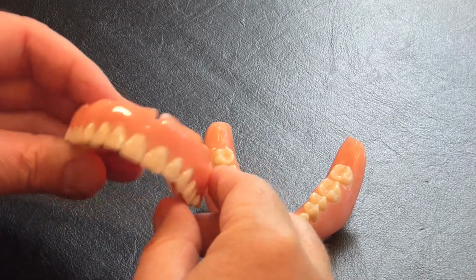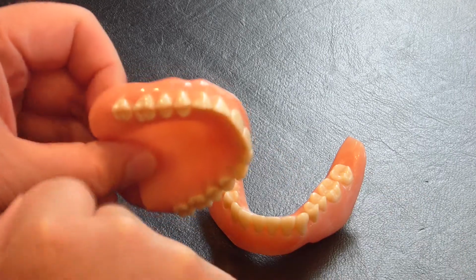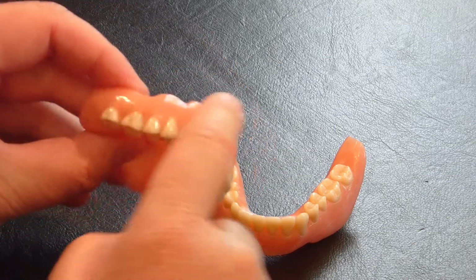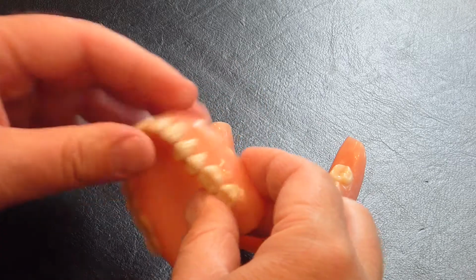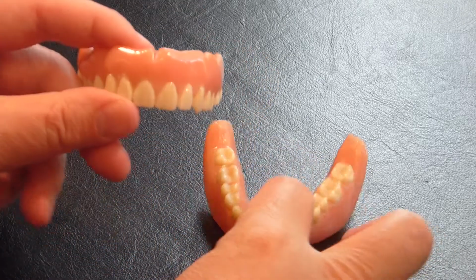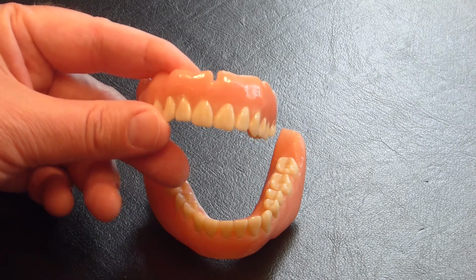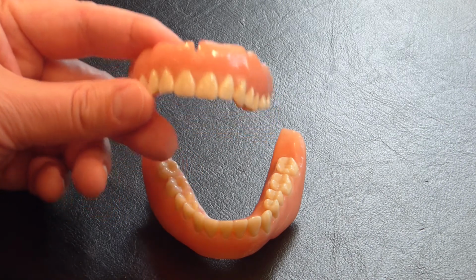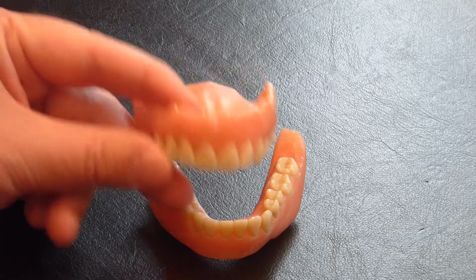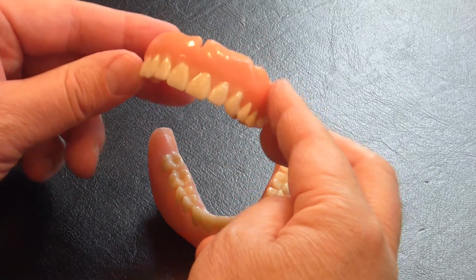To take care of the dentures, what I usually recommend is after you wear them, and so before you go to bed, take them out. Use your toothbrush, just water, brush them all around, just brush all the teeth, because you can still get plaque and tartar buildup on these. Once you give them a good scrub, both sides, all over, then you just put them in a glass or a little dish with some denture cleaner. Those are just some tablets you can buy at the grocery store, the drugstore. You soak them overnight in that, and it'll leave them nice and minty fresh for you, so when you put them in the morning, it tastes like you brushed your teeth.